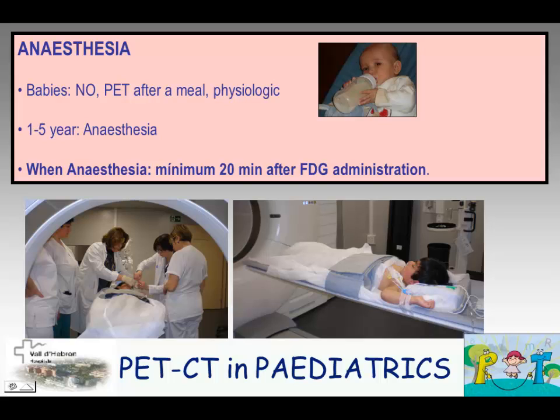And remember that when we are using anesthesia, the pharmaceuticals cannot be administered before 20 minutes after the FDG administration in order to avoid interferences with the FDG uptake.